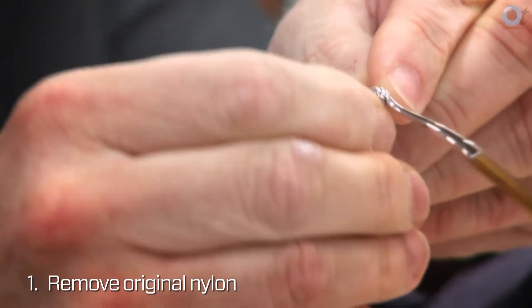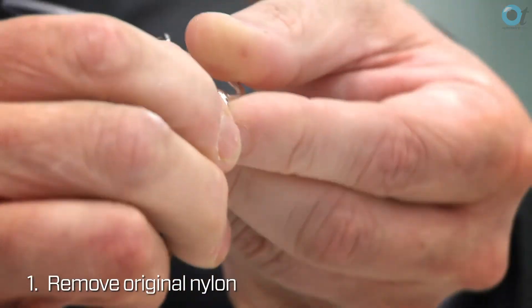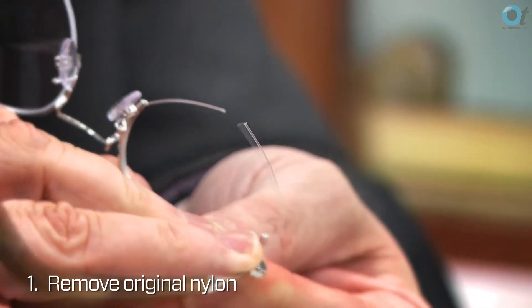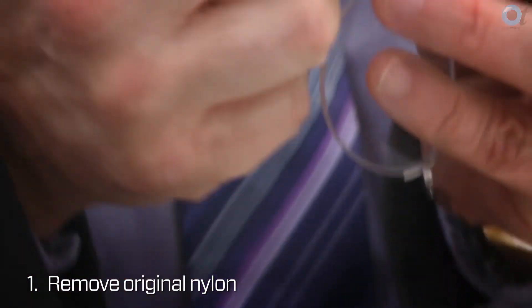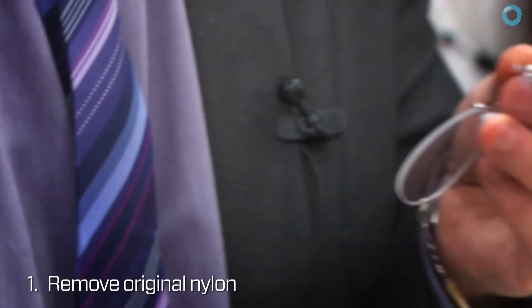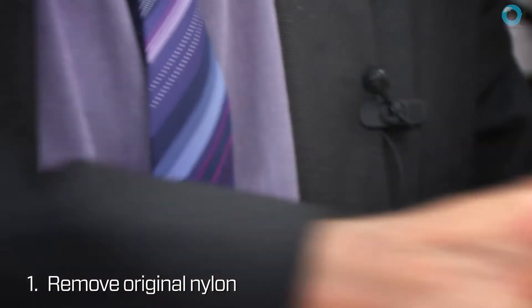A patient has come in with a supra frame where the nylon's broken, so we need to replace it. First we need to remove the original nylon, which can be a little bit tricky but most of the time will come out — sometimes it just needs a little bit of coaxing. And again the other side needs to be removed. So that's the original nylon thread removed.